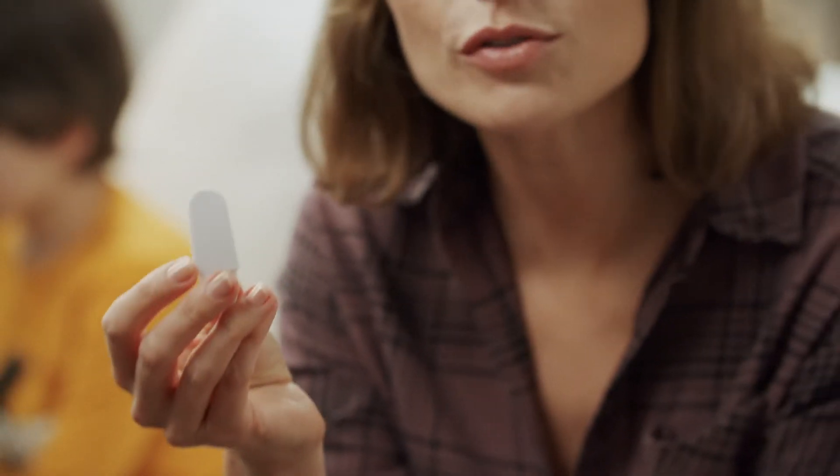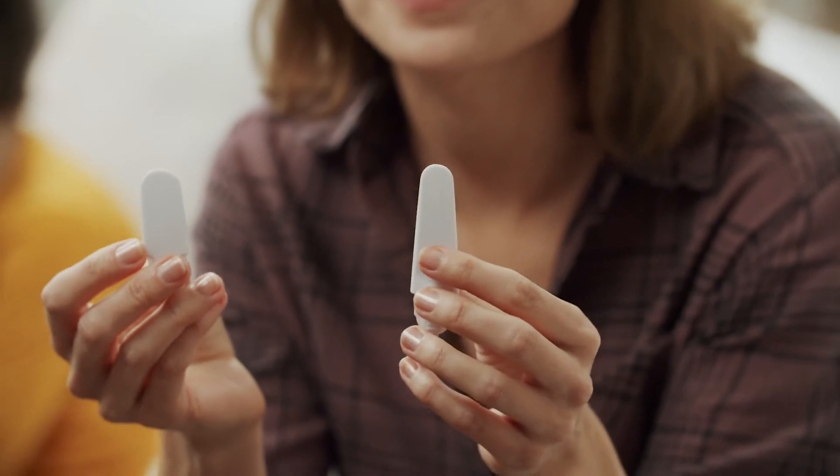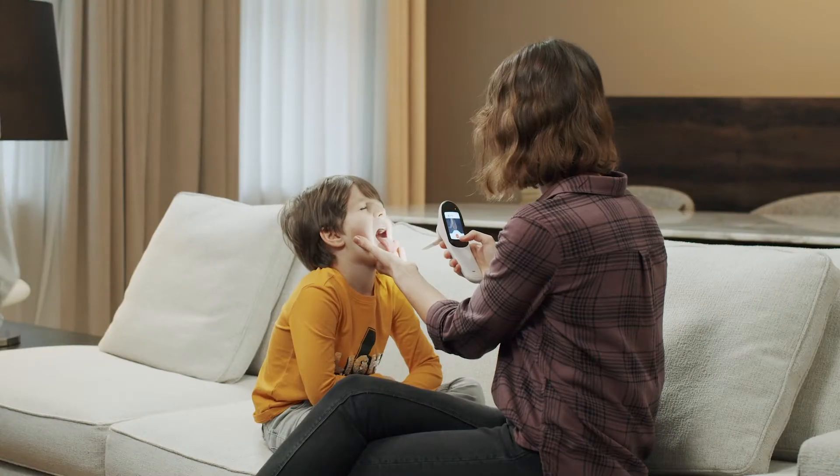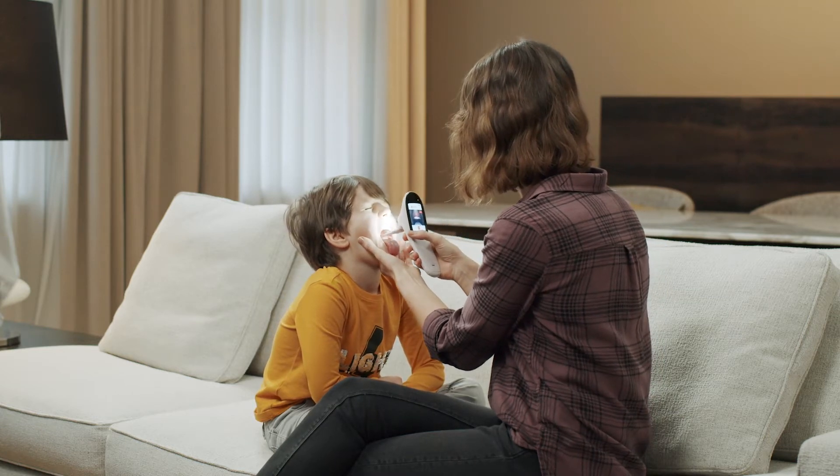And for anyone over 5 years old, use a size L spatula. Gently tilt the patient's head slightly back. This way you and the test subject will be more comfortable.